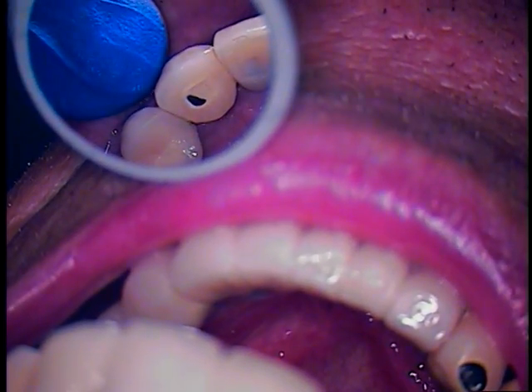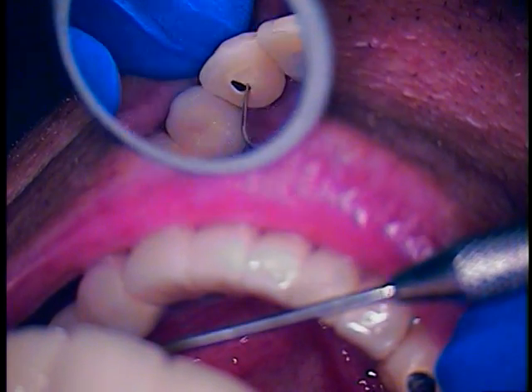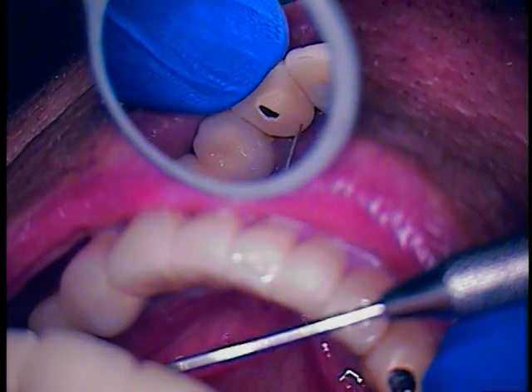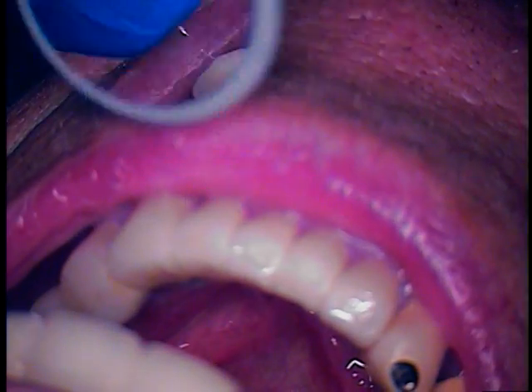Our first thing is to go ahead and use an etched material. I'm going to approach it from the lingual aspect, so I'm going to etch this surface here and this surface right here. We'll put a cotton roll up in there first and also a saliva ejector. For about a minute I'm going to leave you open because we're going to use a special acid etch to clean off the surface of the porcelain.